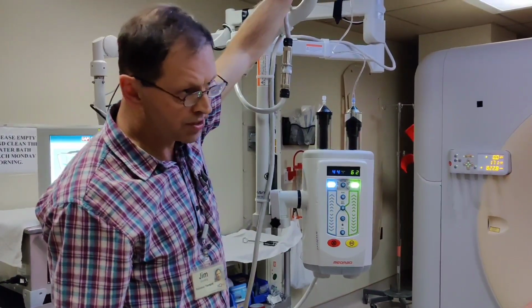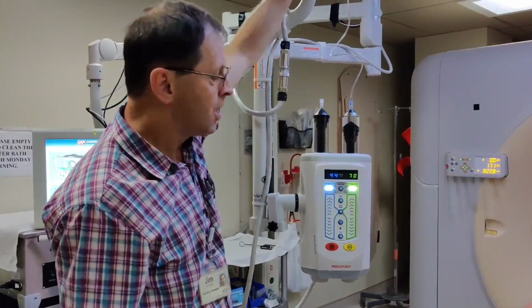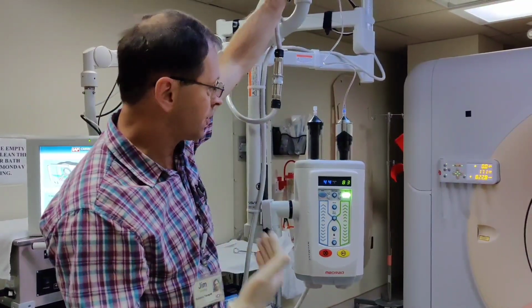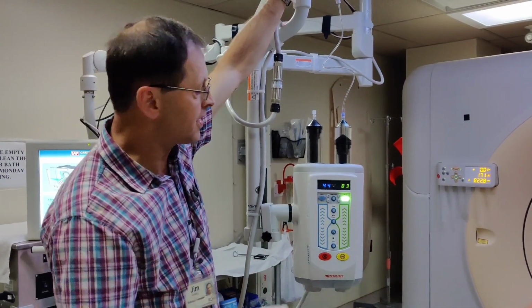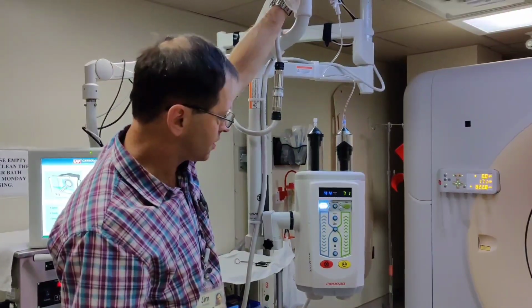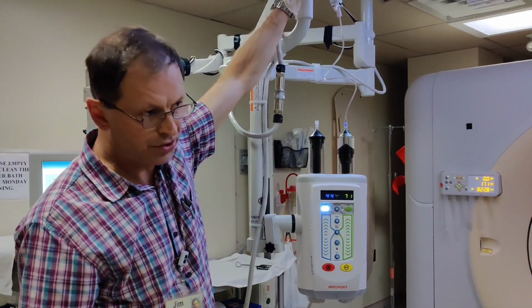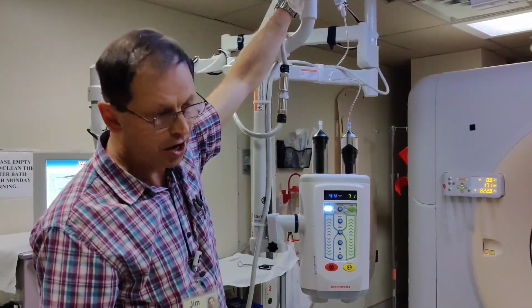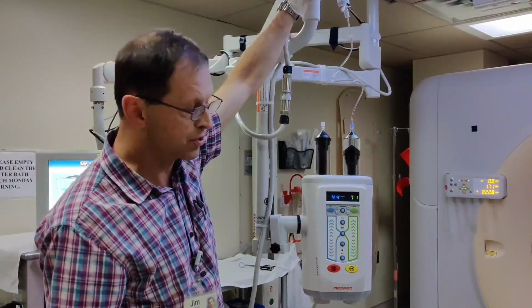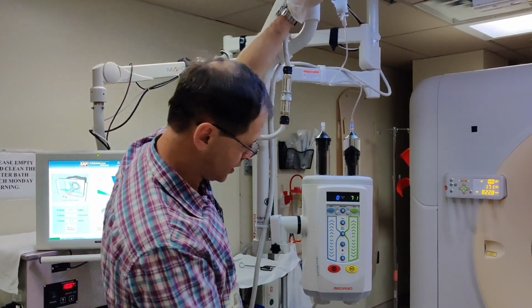What I am going to do once it gets to 70 mils, I know I'm going to need actually more than that to prime the line. So the line that goes from the injector to the IV. So I'm actually going to draw up additional. So it's drawn up 1 mil extra. Our experience has been that's not enough. So I'm actually going to draw up an additional 5 to 10 mils, just so I know I've definitely got enough contrast in here.